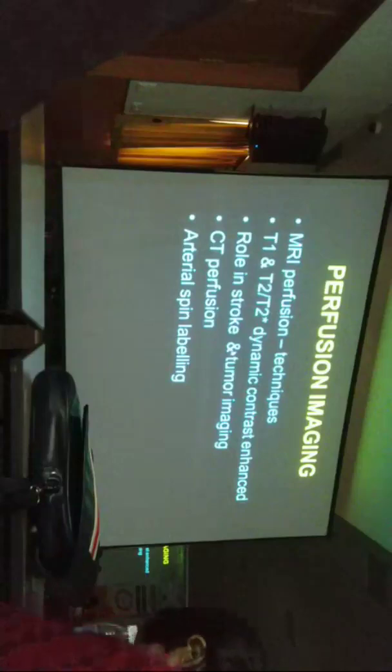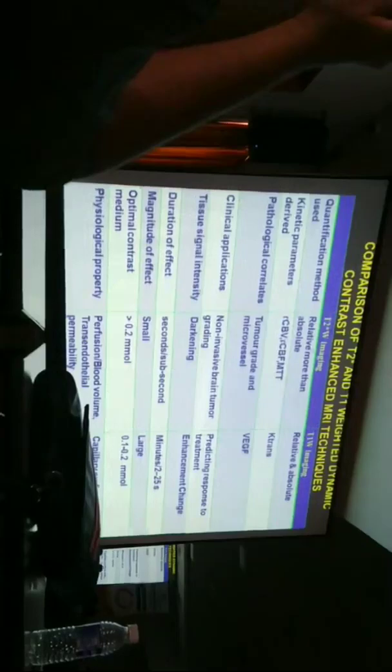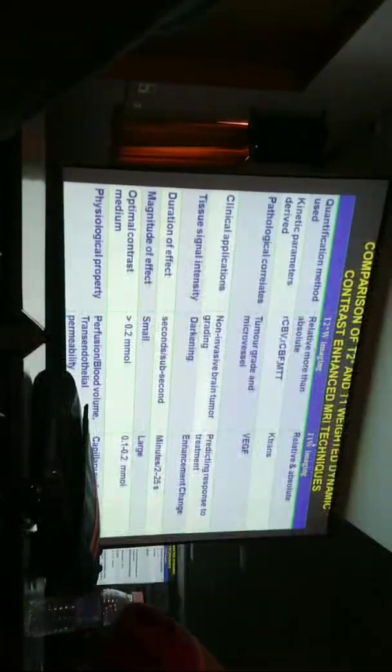Other perfusion techniques include CT perfusion. CT perfusion again exactly quantifies the amount. So what is the difference between the T2 star weighted post contrast perfusion and the T1 post contrast? We measure absolute measurements in case of T1 post contrast.